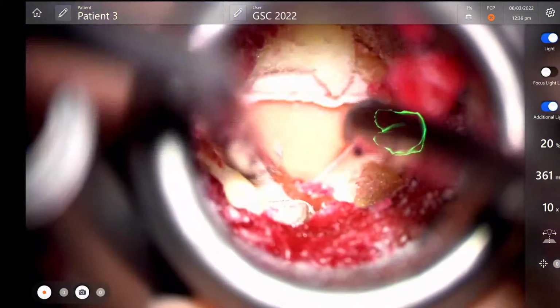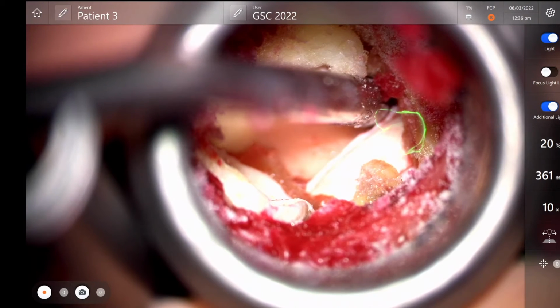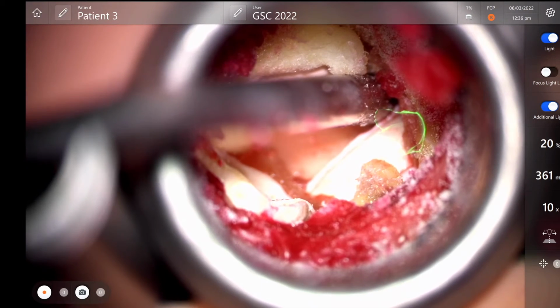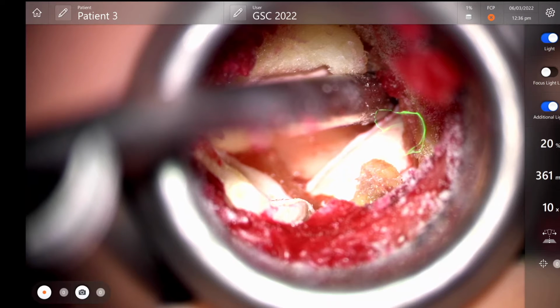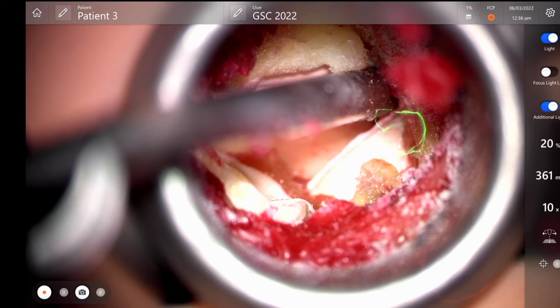So that's kind of like what we call the Kambin's triangle here. Dr. Hartl, is there a way to know where the pedicle is? I know you put the screws in, but let's say virtually, can we see the pedicle, or at least see where it is when we do the... Voila. That's the pedicle, or Taylor's going to show us the pedicle.